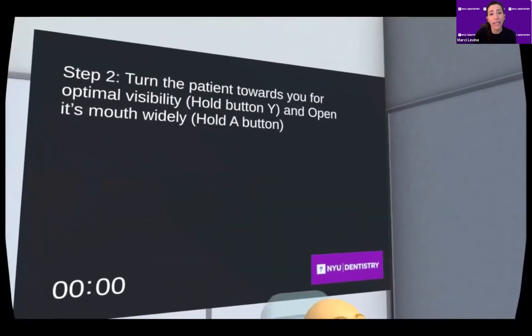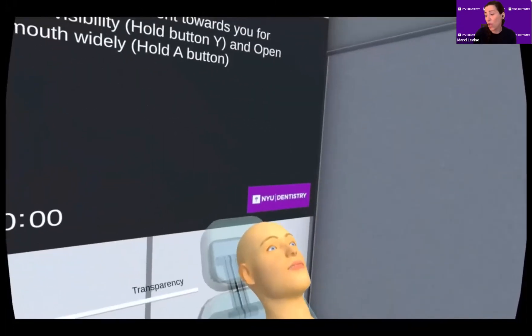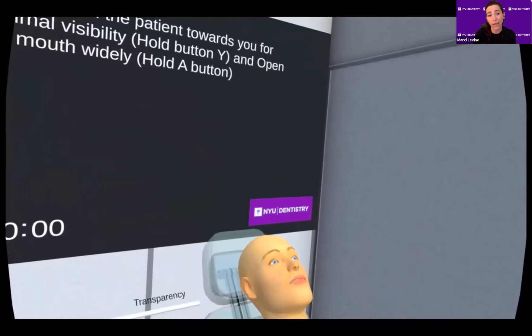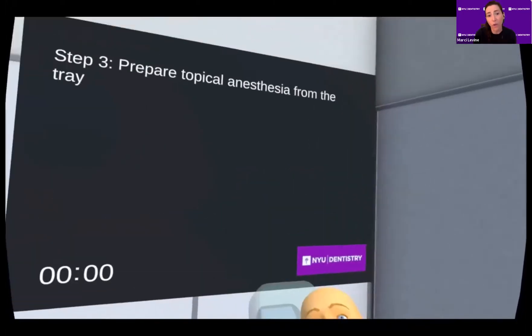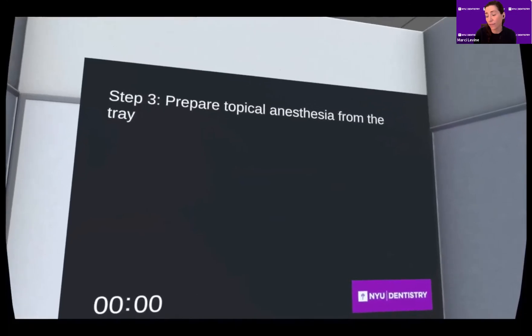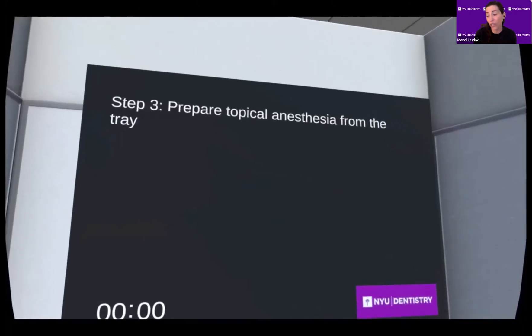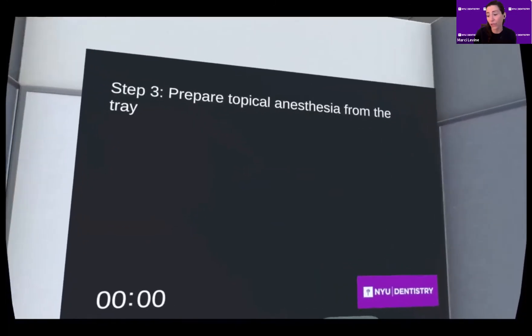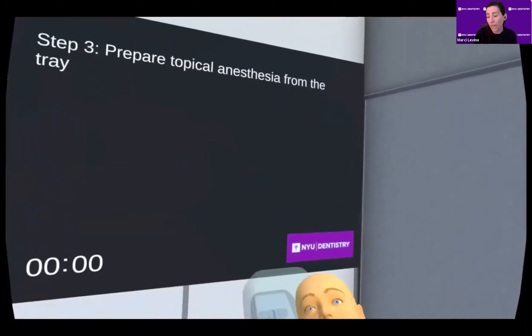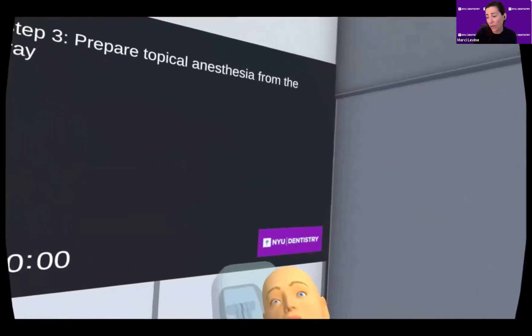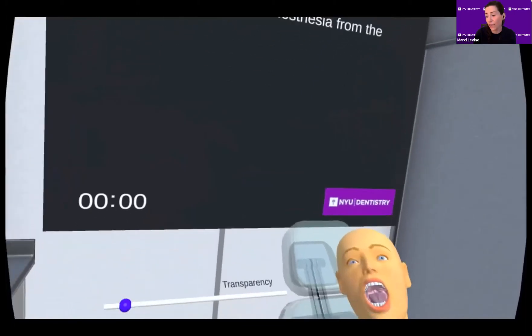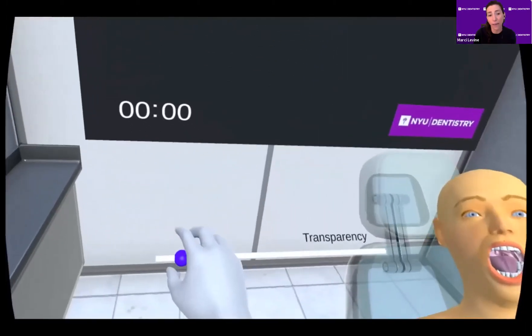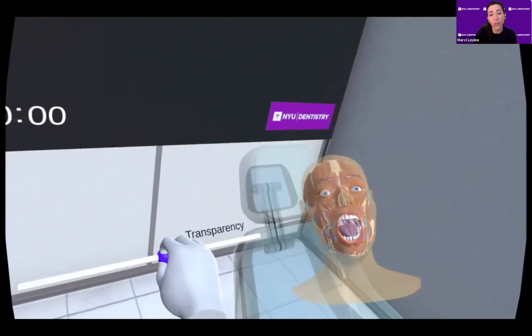Students use hand controllers to properly position the patient in the semi-supine position, and they will hear a chime when they do a task correctly. The patient is turned and oriented toward the student. When something is done incorrectly, they also hear a sound, and they receive a vibration sensation in the hand piece for double feedback.